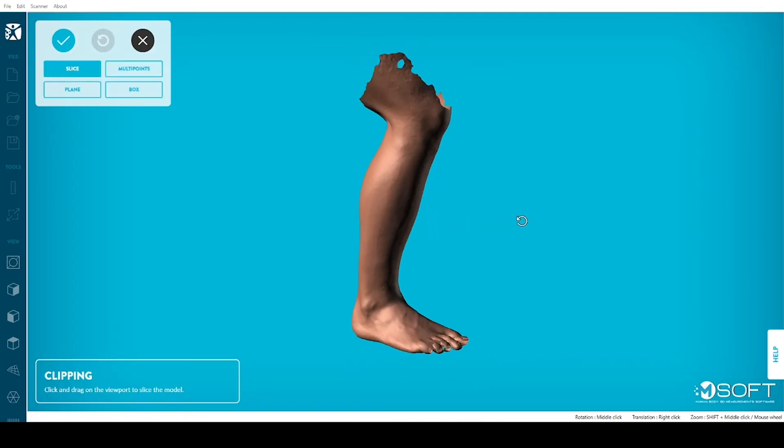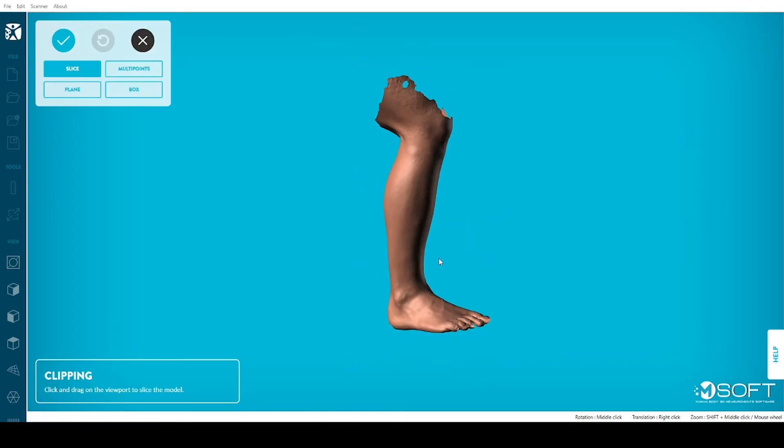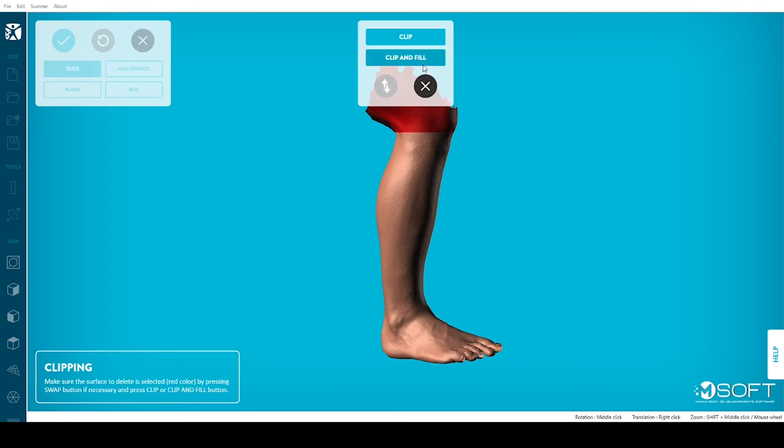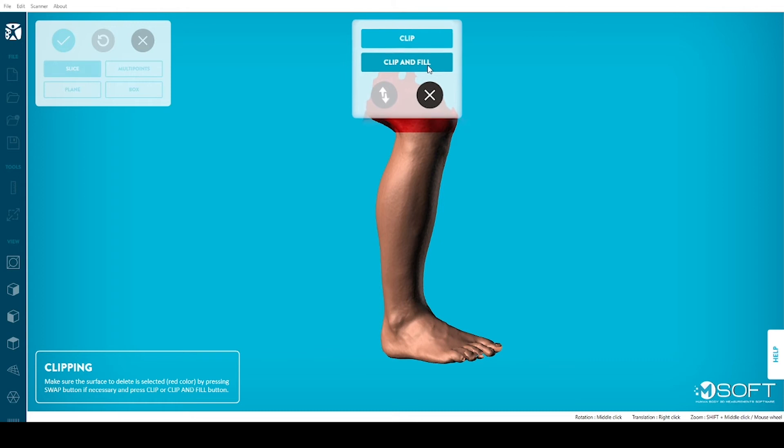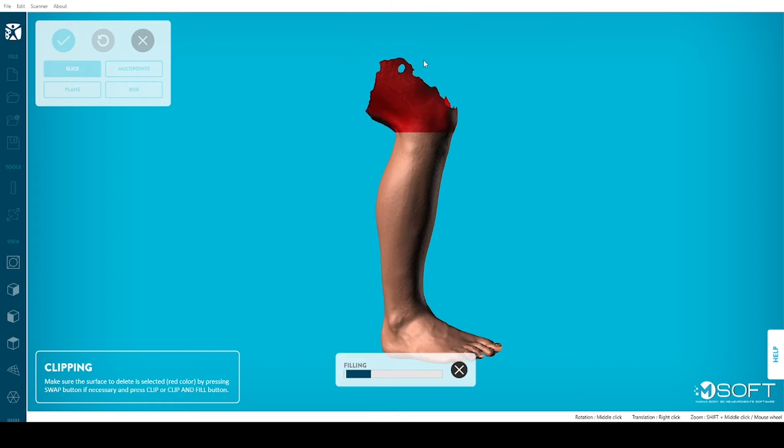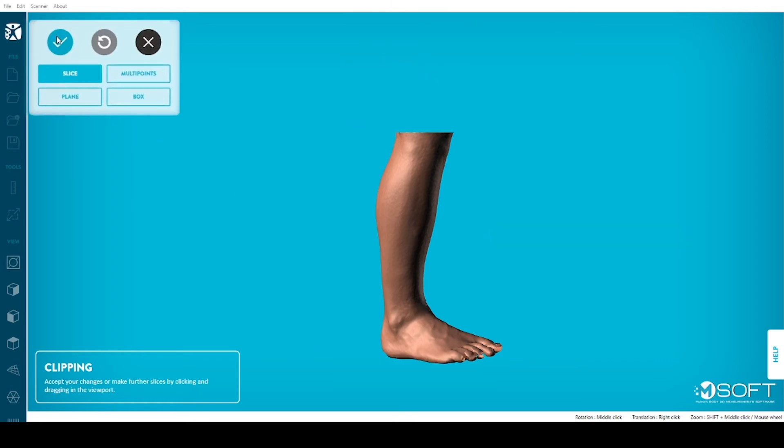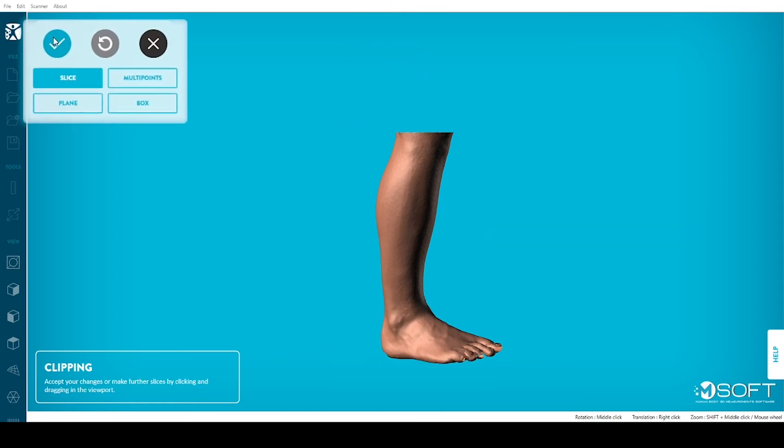Click and drag to draw a line where you want to slice your model. Click on Clip and Fill. When you are done, click on the blue checkmark.